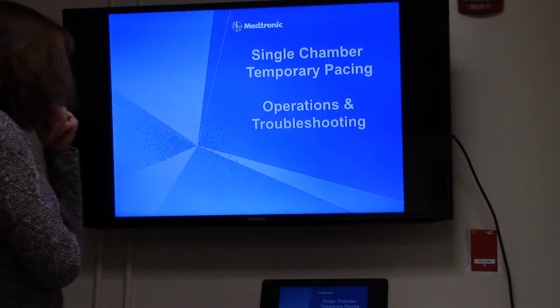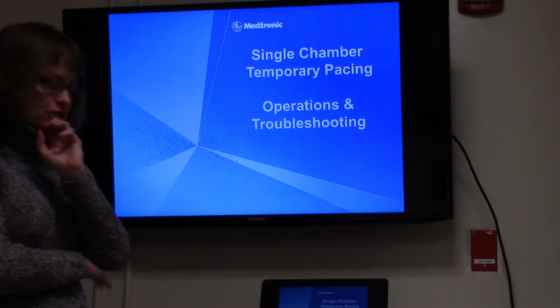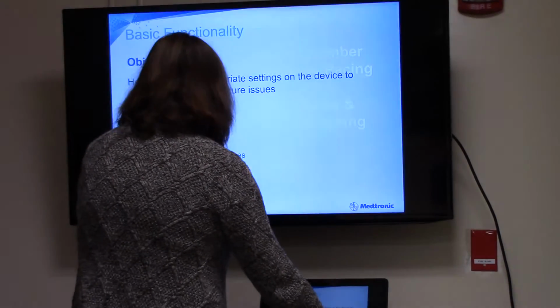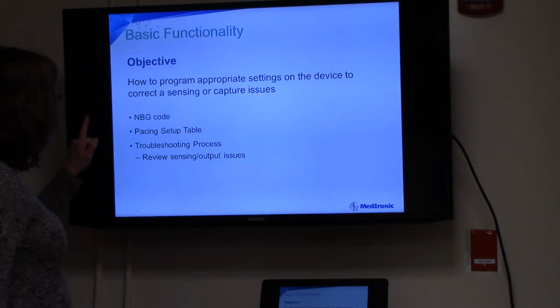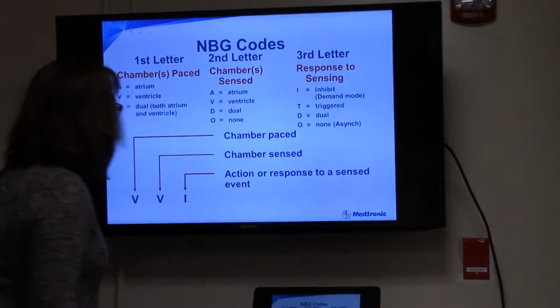Good. Okay, so I'm going to gear this more towards what you're going to see with your TAVR patients when they come out. So just basic stuff. So we'll go over the code, some troubleshooting, things like that.